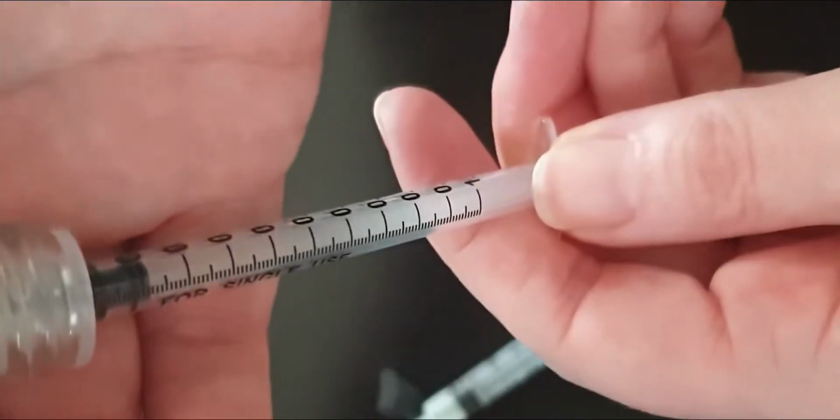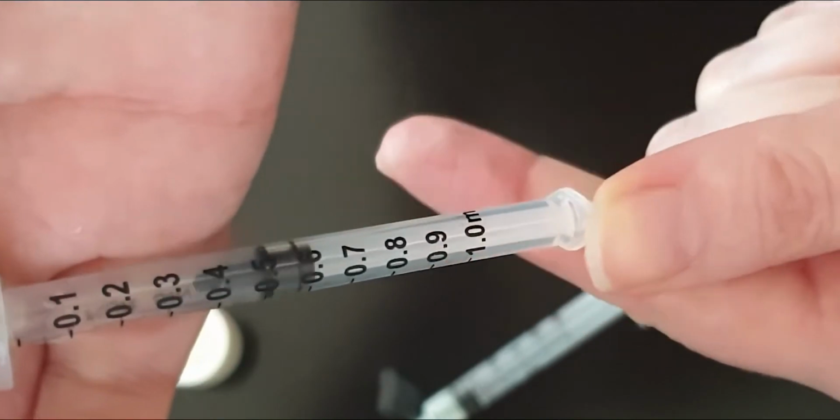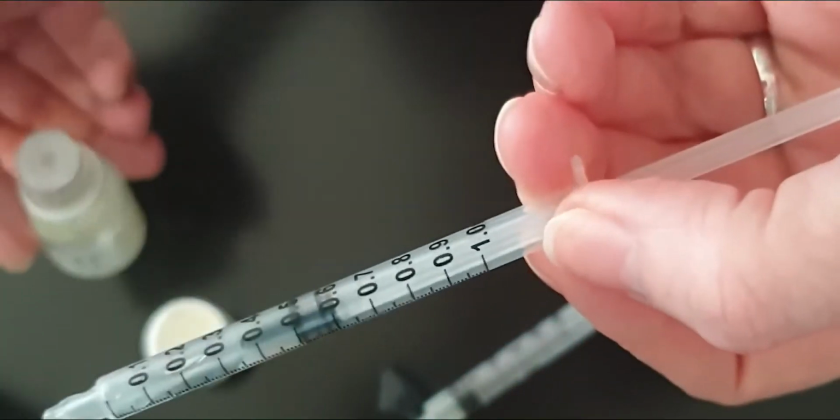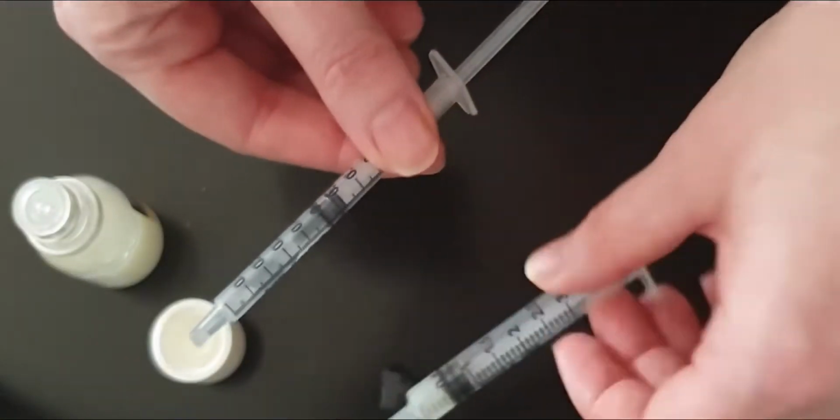I'll show you the same amount on the smaller syringe. Drawing up to here would be 0.5. So 0.5 there and 0.5 here, that's the same amount.